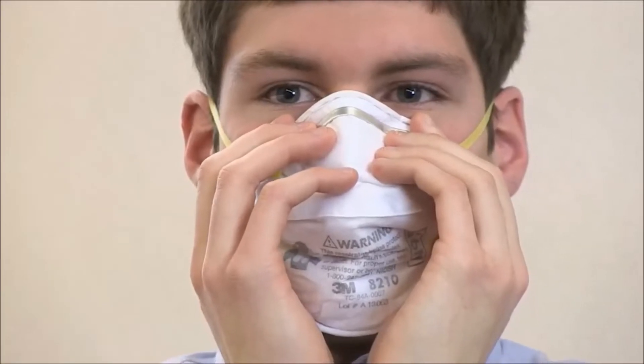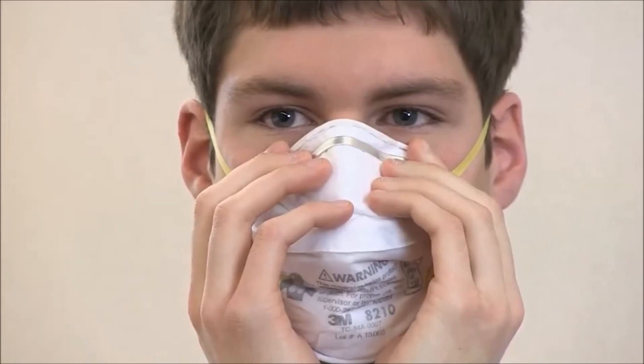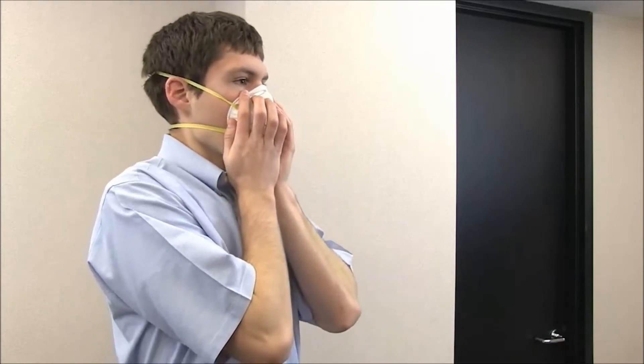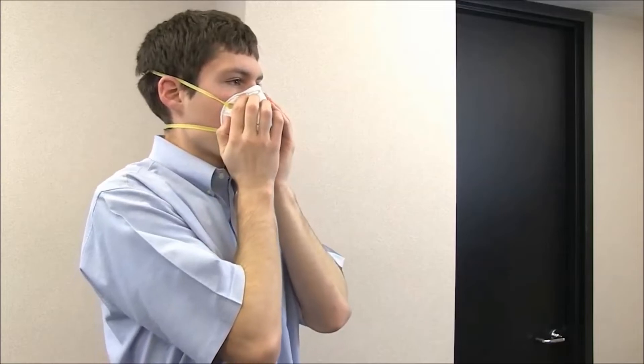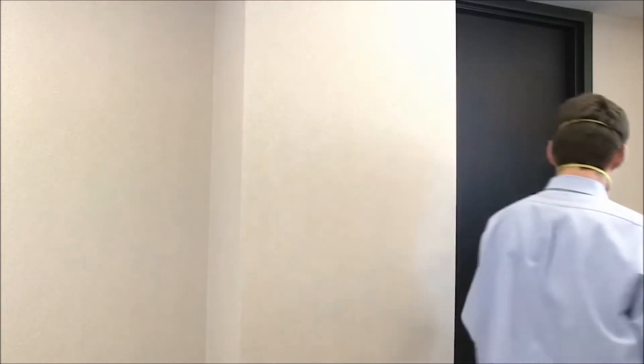First, place one or both hands gently on the outside of the respirator. Inhale and exhale forcefully, making sure no air leaks from the edges. If you do notice leakage, reposition the respirator on your face and readjust the nose piece. Repeat this test until your respirator fits properly without air leakage.